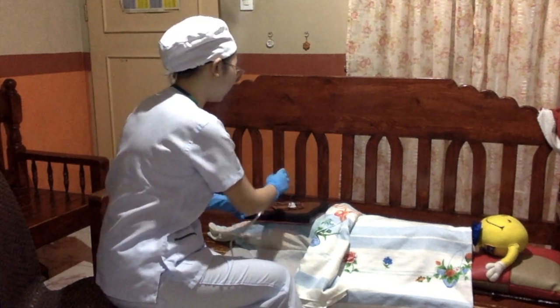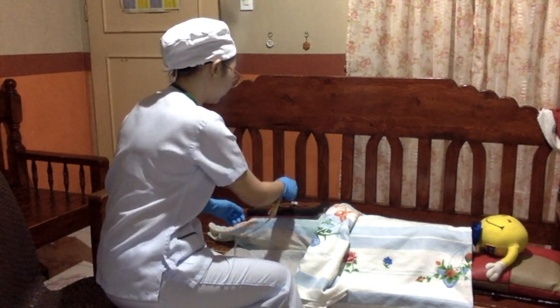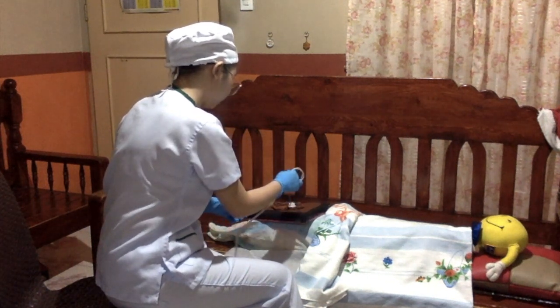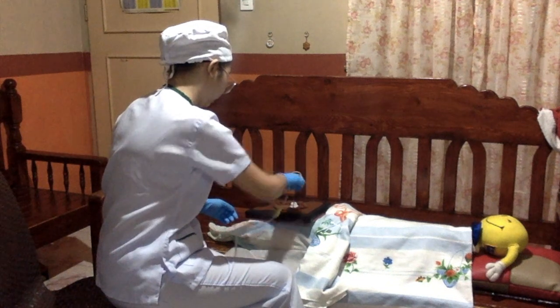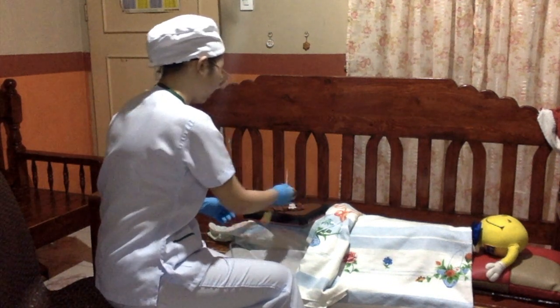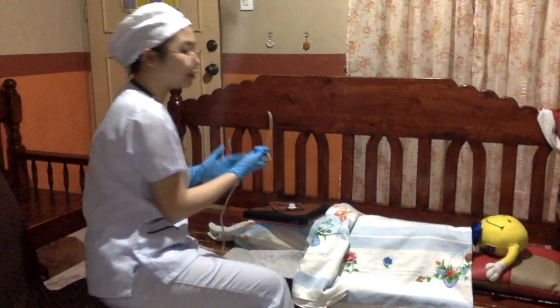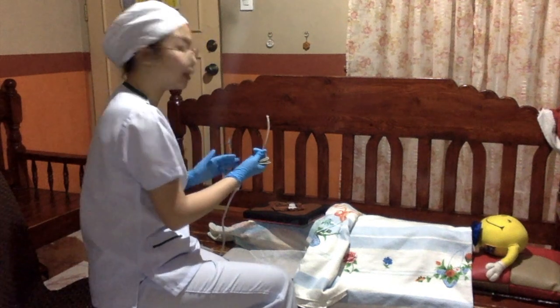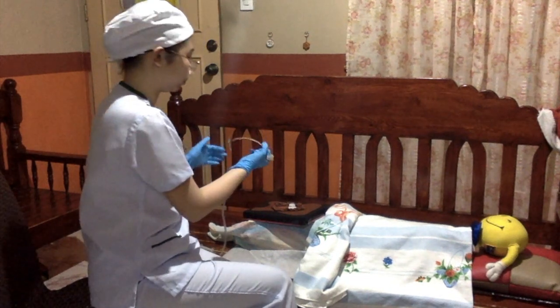Okay? Then after that, hold the catheter up until the urine is completely drained to the drainage bag. After that, I will clear the bed of all equipment.